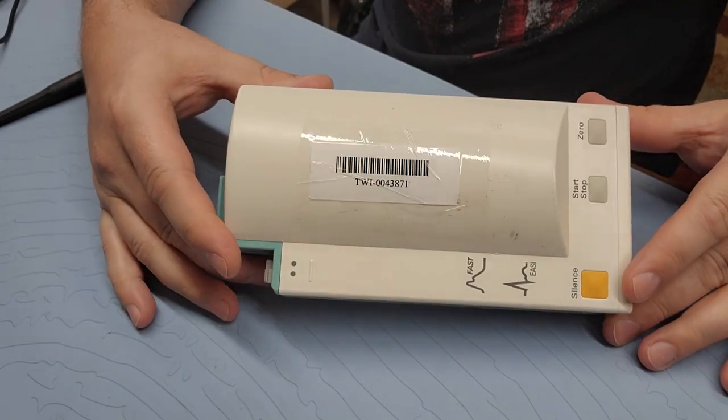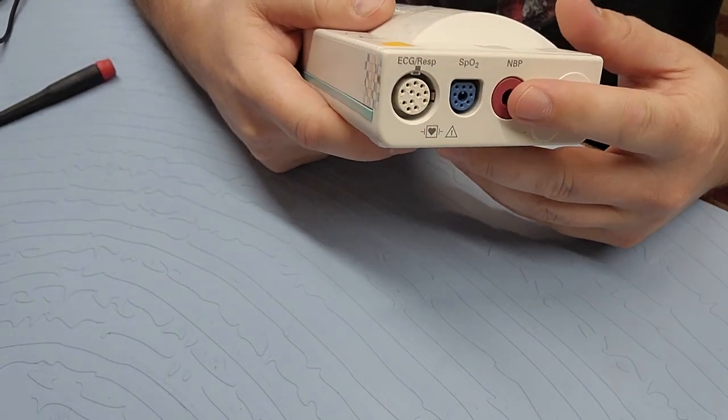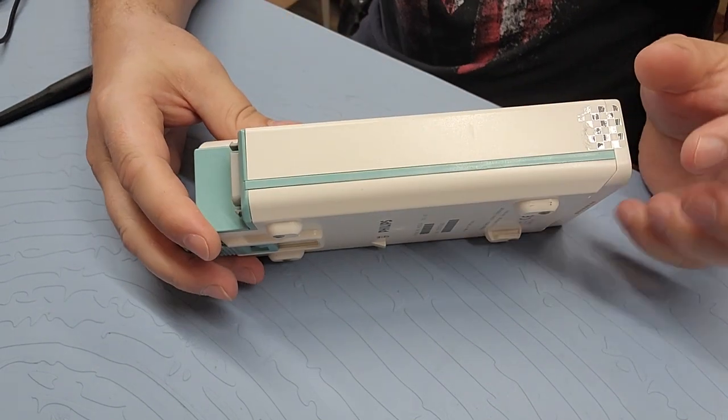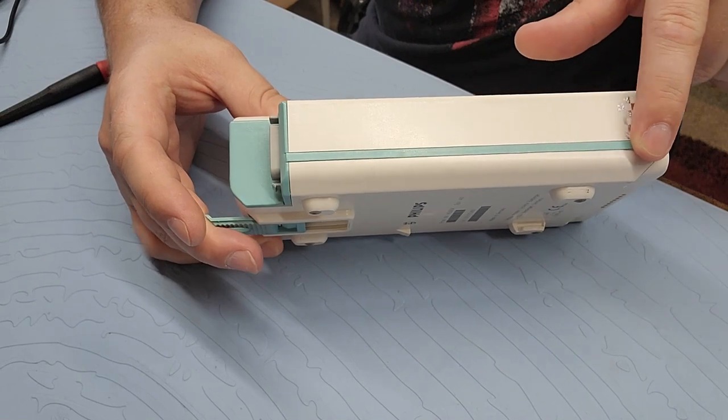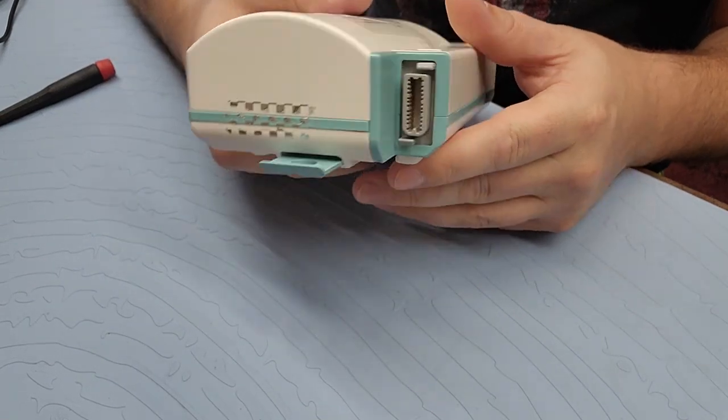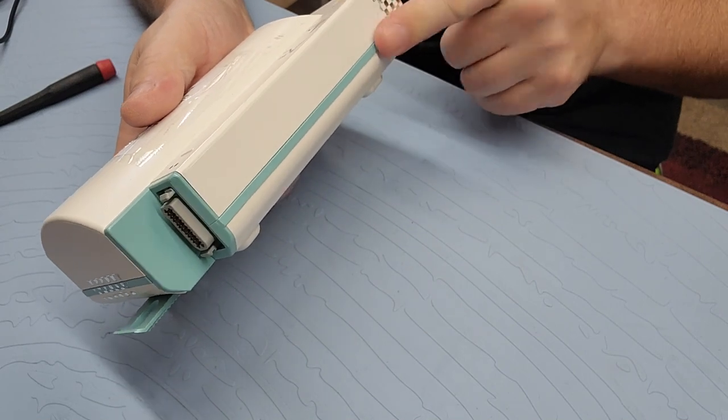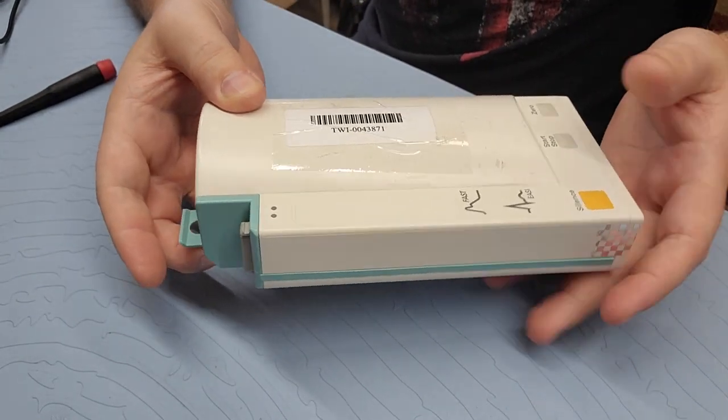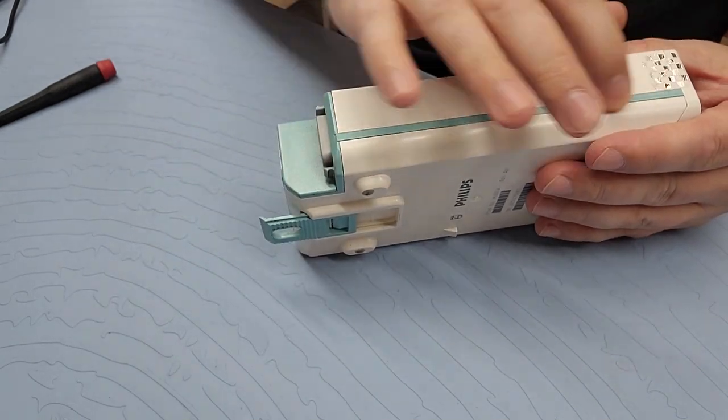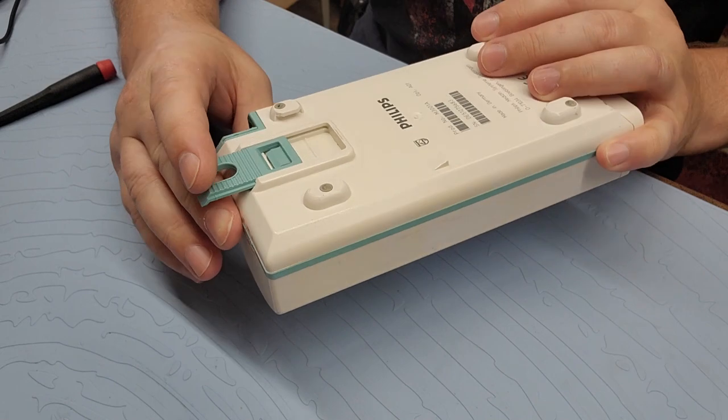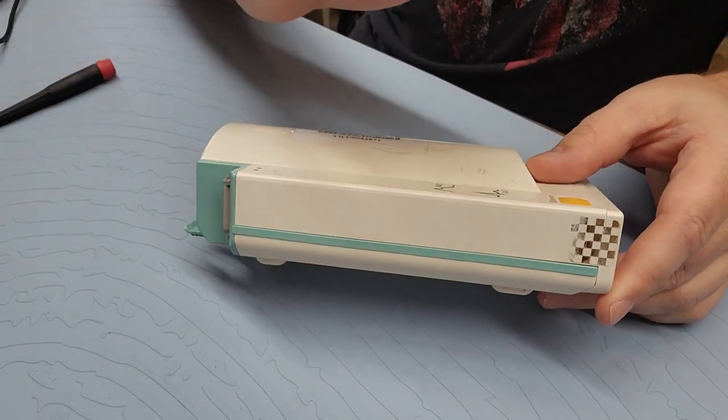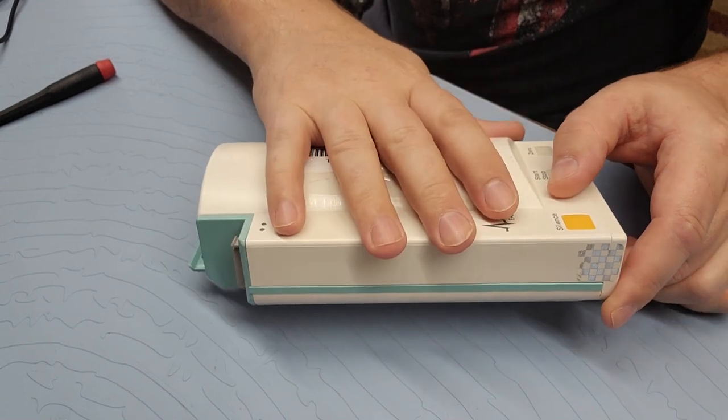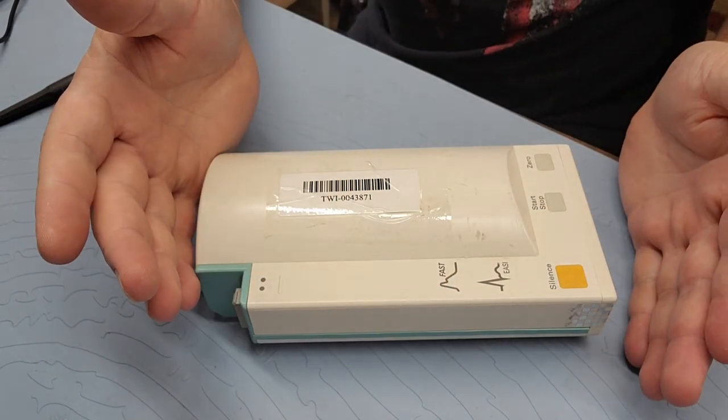Philips has several variants of this module, not just in the parameters but also in the software. And one of the biggest indicators for the various software is this coloring right here, which this one's got the teal. You can see this one here is probably an older version, but that's okay because it still works with a majority of monitors. The key thing to know is that the software inside this guy has to be compatible with the software in the patient monitor.